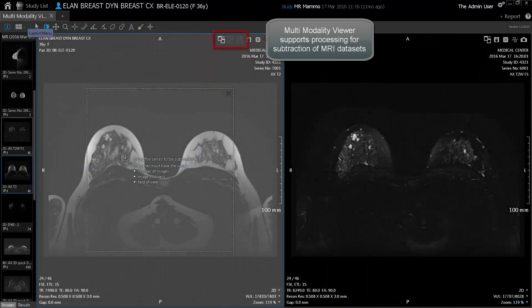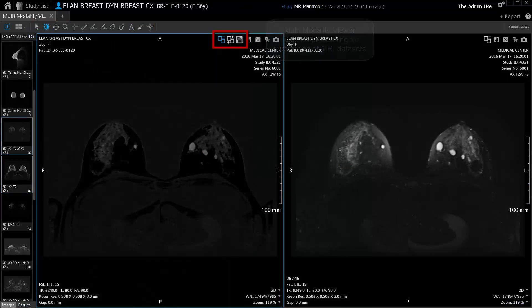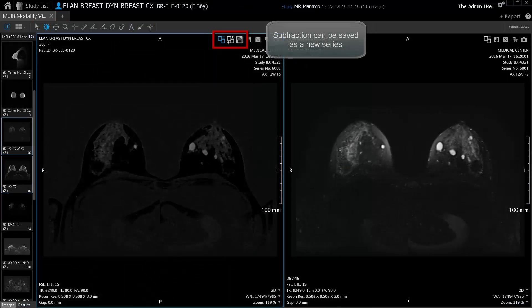Multi-modality Viewer supports processing for subtraction of MR datasets. Subtraction can be saved as a new series.